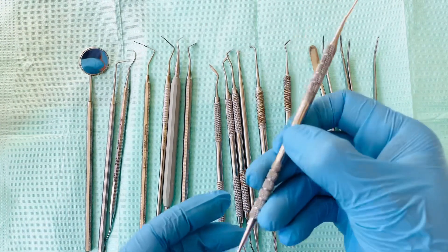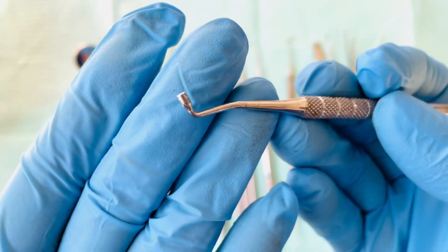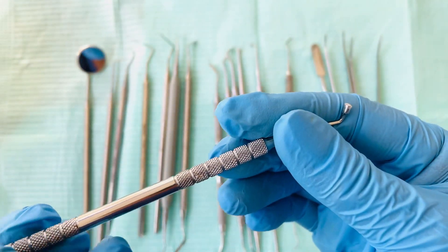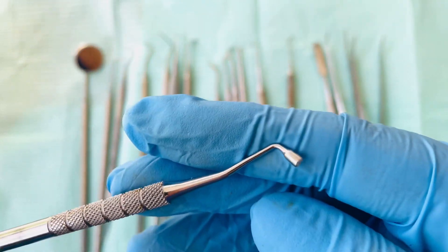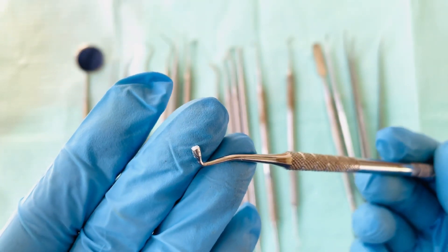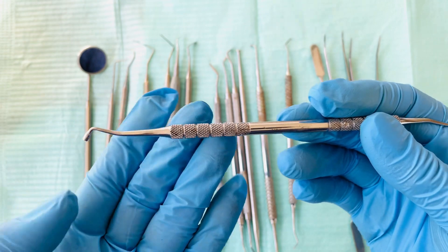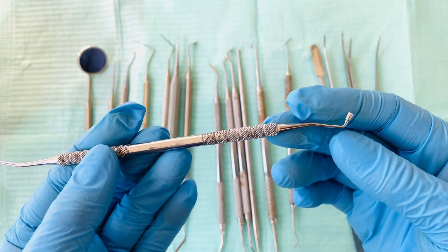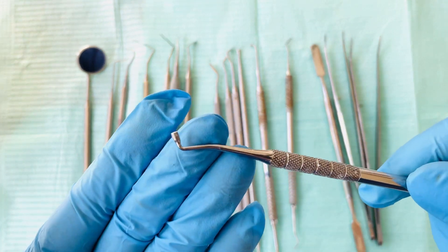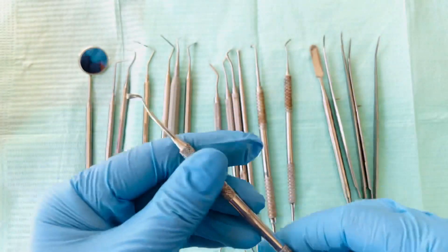Next we have the plugger, or amalgam plugger. It has a bigger end and a smaller end. This is used to push or plug your amalgam fillings inside the cavity. That is the amalgam plugger.